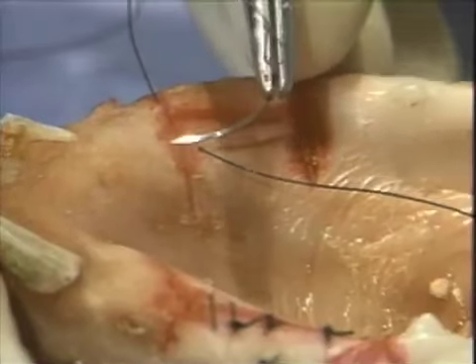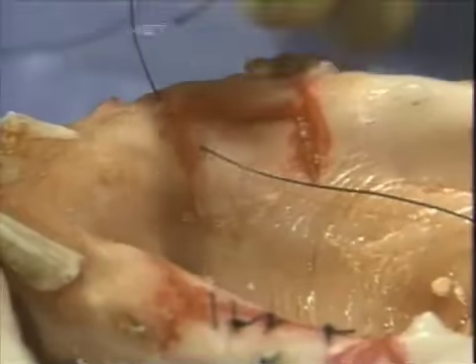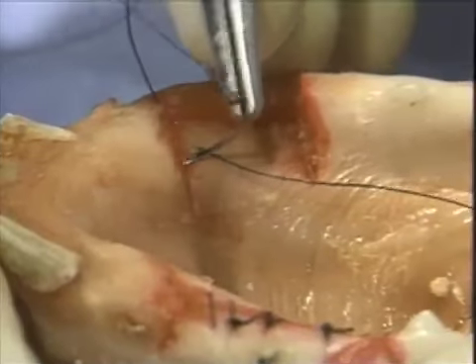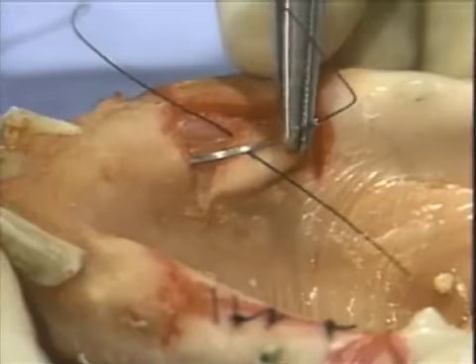We will deliberately position the suture needle apical to the initial placement of the suture in keratinized tissue of the surrounding tissue.